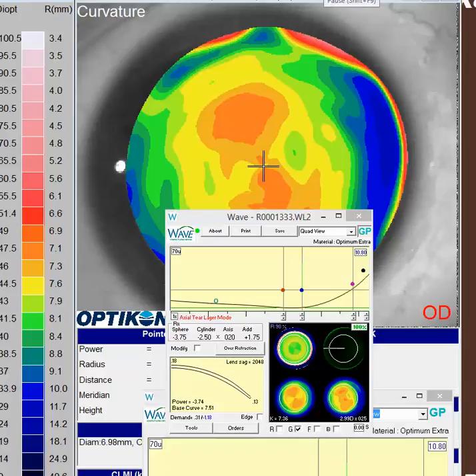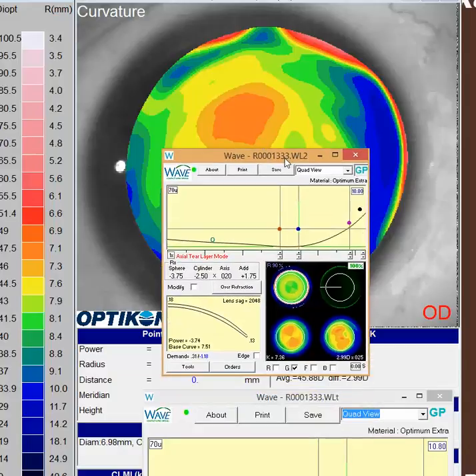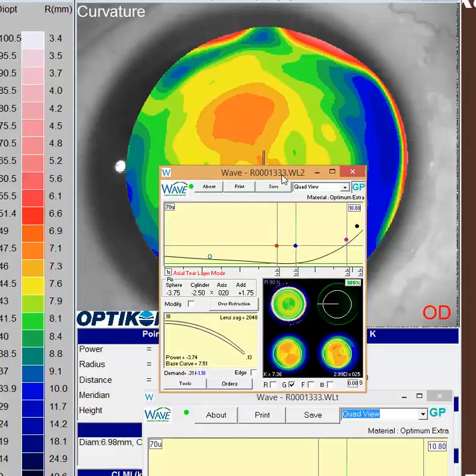I see from your clinical request that your redesign is working a little bit better from a fitting standpoint. It looks like your recapture of that lens with the topography is giving you a better representation of this cornea, but it sounds like the lenses are still maybe a little bit on the steep side and you're concerned about centration. From the videos that you attached, as you know, those lenses actually fit pretty well.